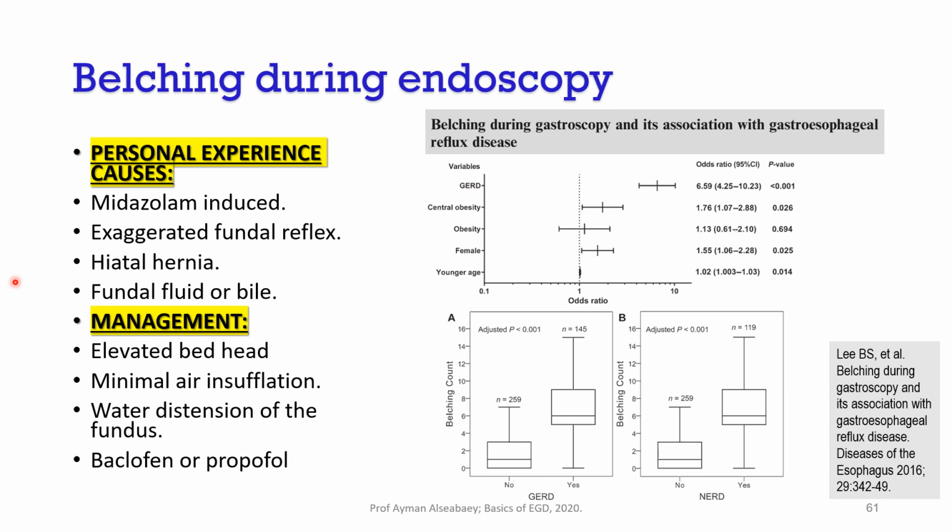I tried to solve this problem by elevating the head of the bed and using minimal air insufflation. Sometimes I distend the fundus with water, while the patient is at 45 degrees. Of course, baclofen before endoscopy or propofol relaxes the fundus and prevents the irritation.